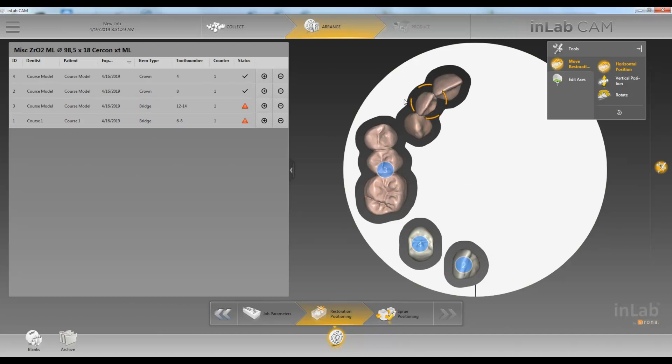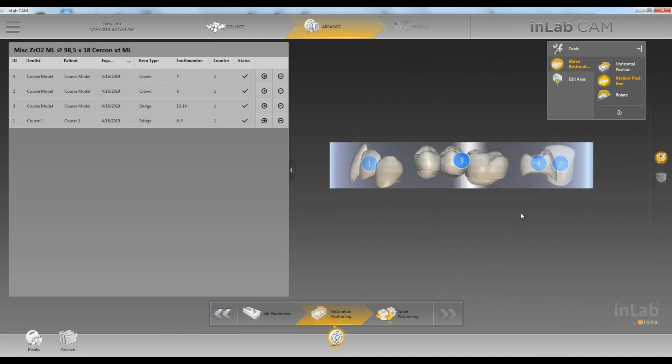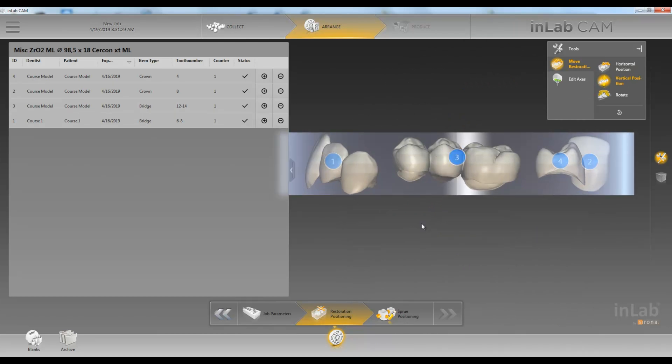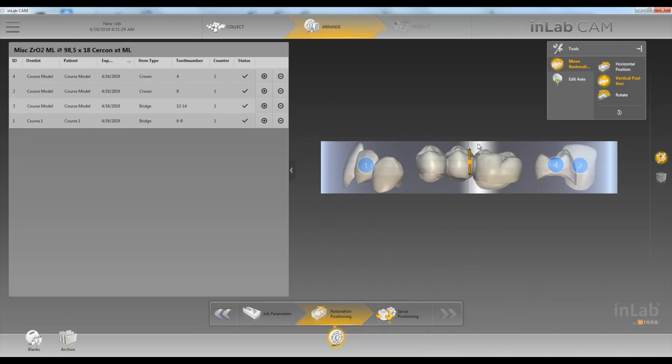Next, once we're happy with where our restorations are, we'll click on Vertical Position. In here you can see there are different gradients in our disc that show there's more incisal at the top. So if you want to have more incisal, we'll lift our restorations up. If we want less incisal, we'll pull it down. We found that we like to keep it close to the top.